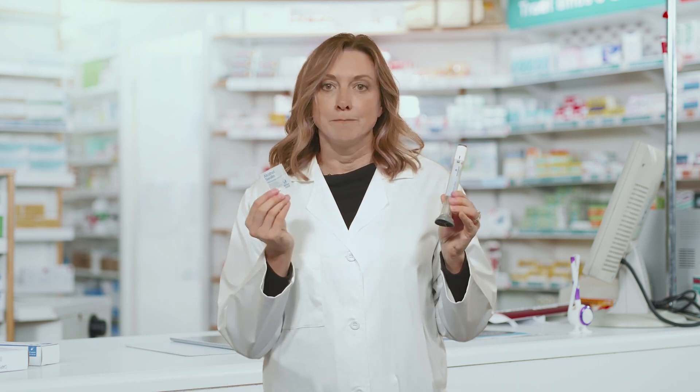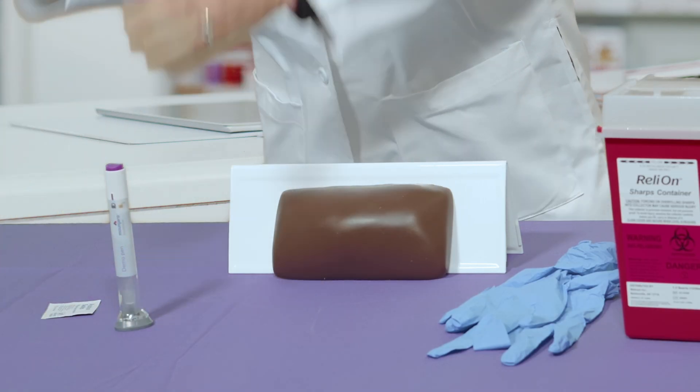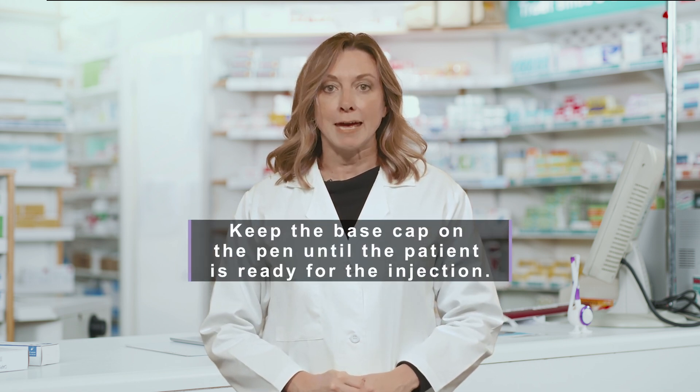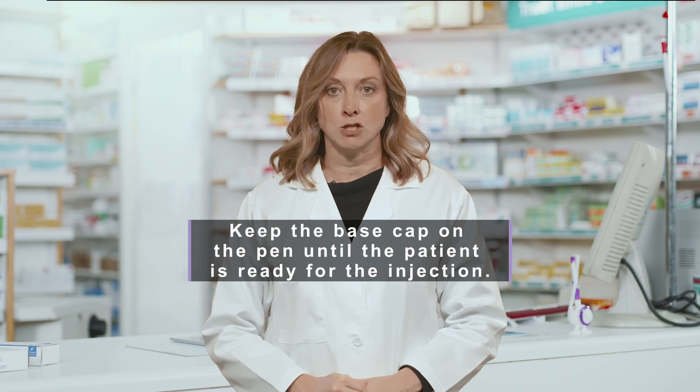To prepare for the injection, you'll need the pen and an alcohol swab. Each box comes with four pens. Keep the pens in the fridge until use. Take the pen out and let it come to room temperature, which takes around 15 minutes. Keep the base cap on the pen until the patient is ready for the injection.